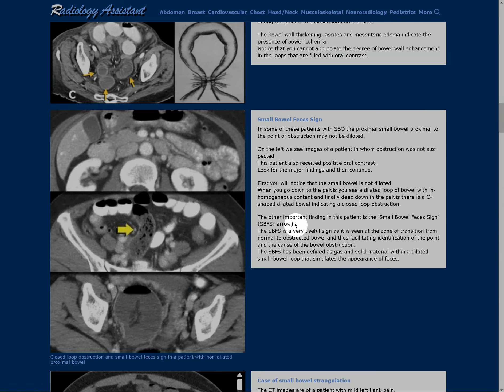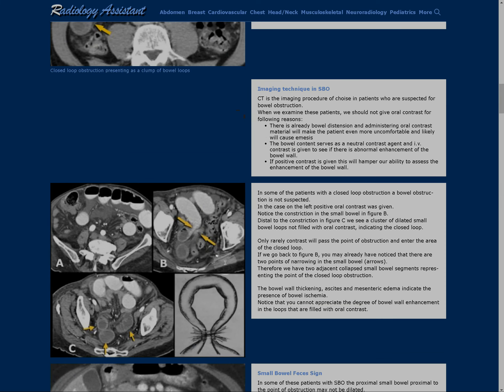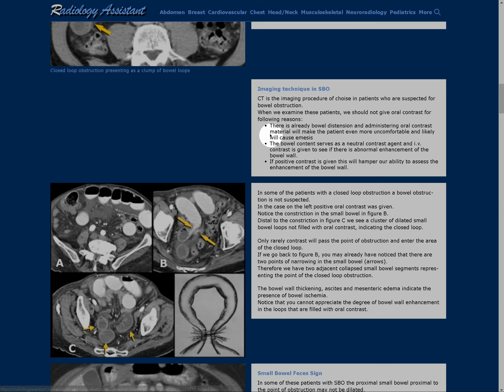The main thing you want to find in a closed loop obstruction is that you see two loops of bowel with a sign called birdbeaking. It just narrows and widens, narrows and widens, and they should be pretty close to each other. If you see that, that is the finding for closed loop obstruction.